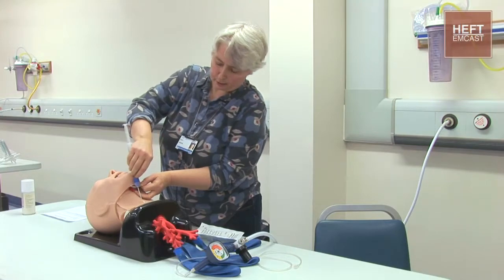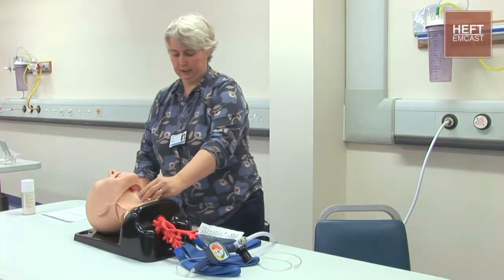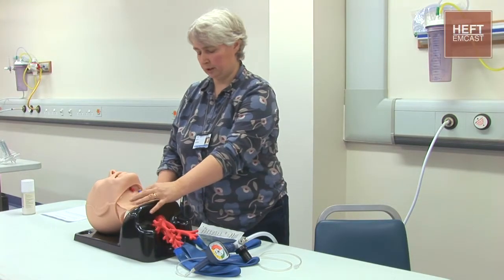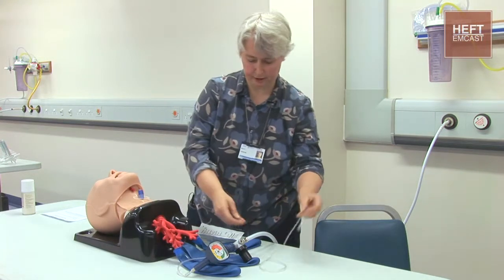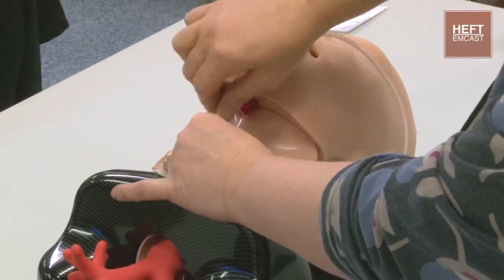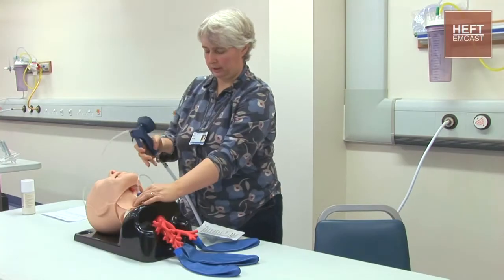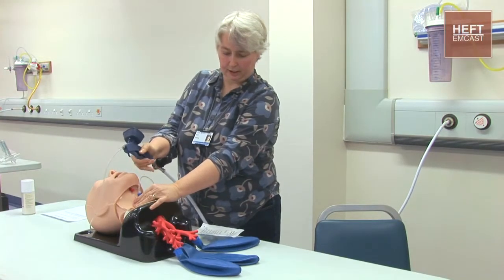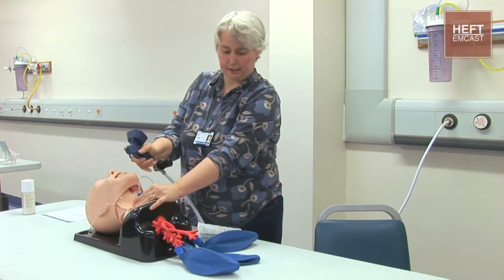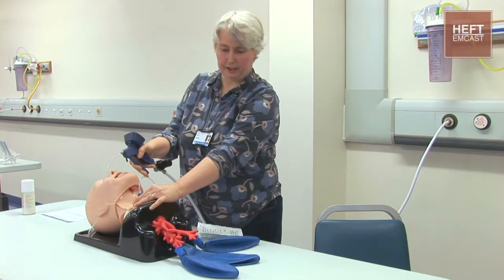So I can pull the needle back a little bit, advance the catheter, and remove the needle. In this situation it's very important to either hold it yourself or get someone to hold on to it so it doesn't fly out when you attach the ManuJet. You therefore attach to that knob there, making sure it's secure, hold it there, and then hopefully you can see now that we have got some lung inflation and we're oxygenating the patient.